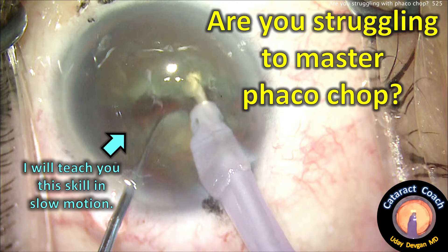cataractcoach.com. Are you struggling to master phaco chop? I will teach you this skill in slow motion.